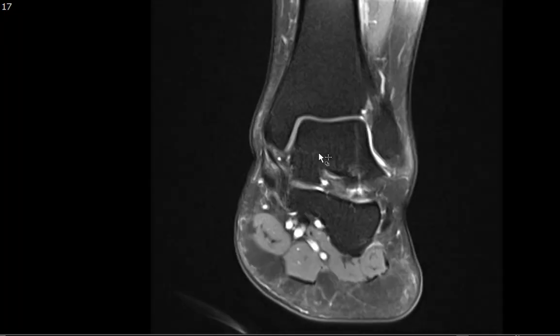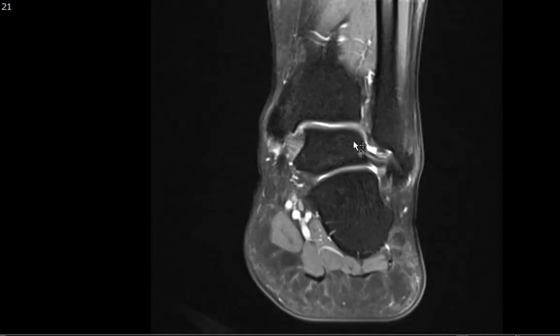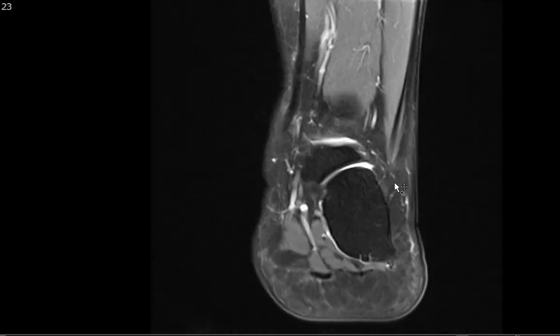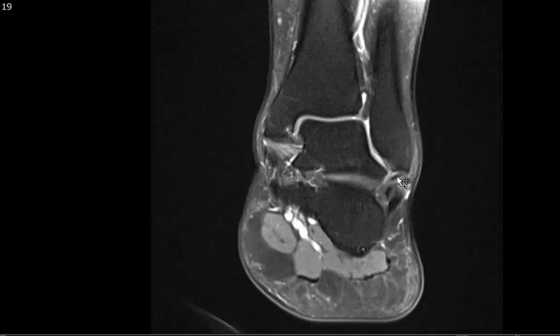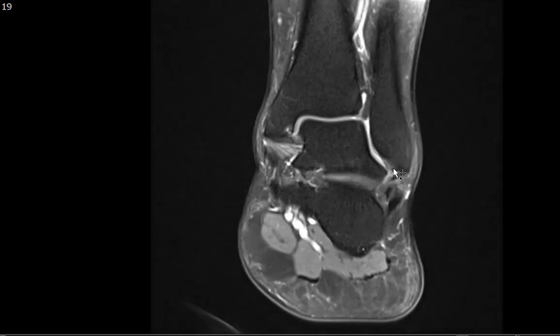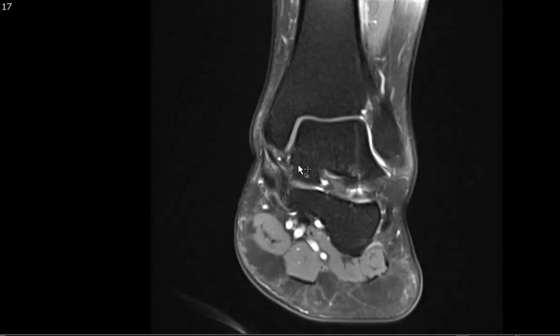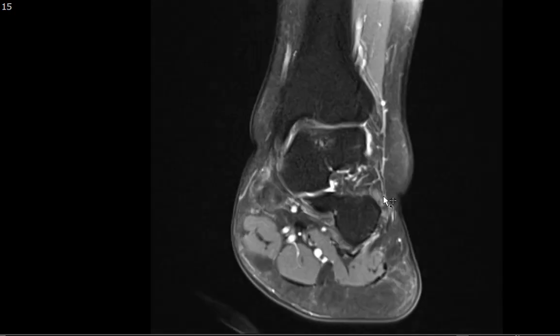Laterally, there are about five ligaments to look at: the anterior and posterior tibiofibular ligaments (syndesmotic ligaments), the anterior and posterior talofibular ligaments, and the calcaneofibular ligament. I want to draw your attention particularly to the calcaneofibular ligament, running between the fibula and the calcaneus, because it's best seen on the coronal view — not well seen on the sagittal or axial. You can also see part of the talofibular ligament running between the fibula and the talus here. The deltoid and calcaneofibular ligaments are really best seen on the coronal view.